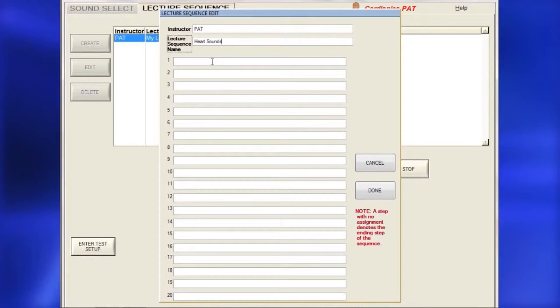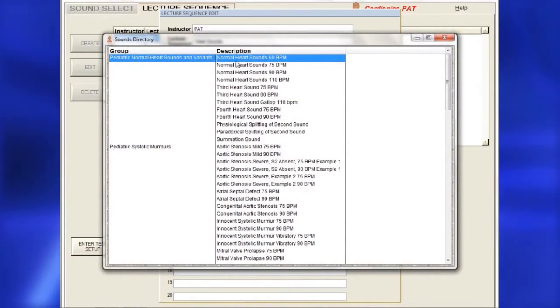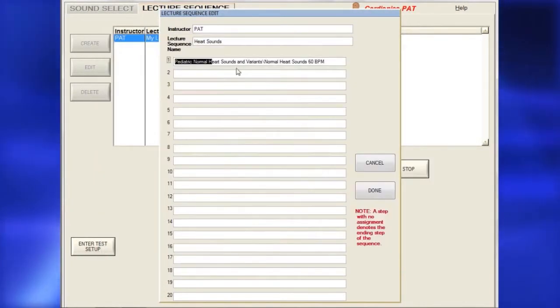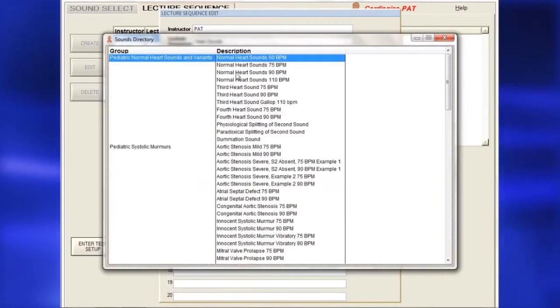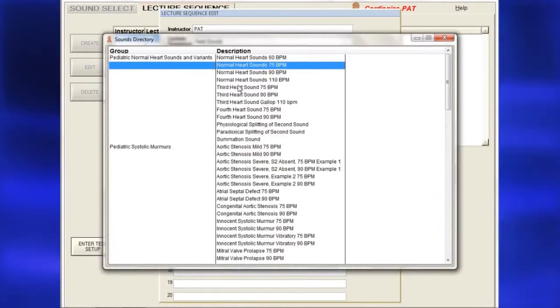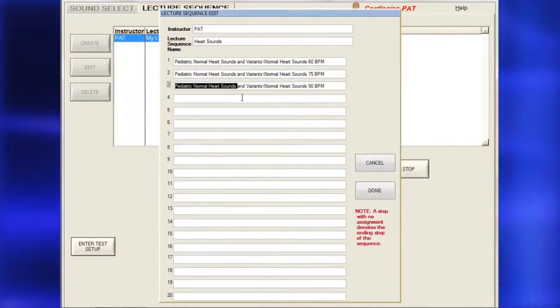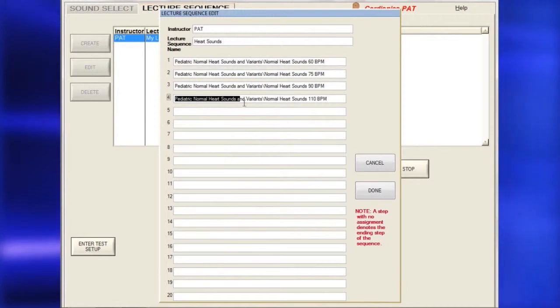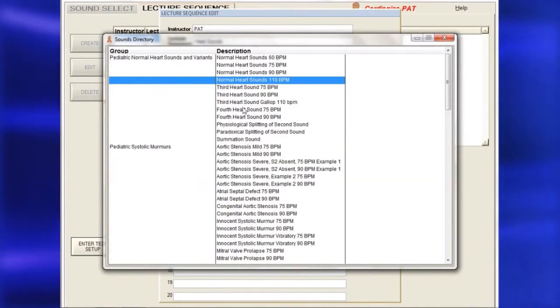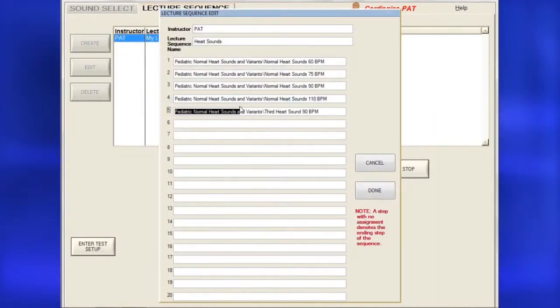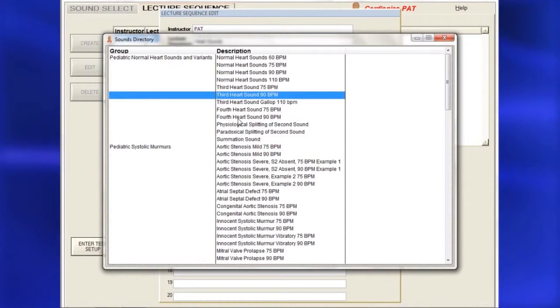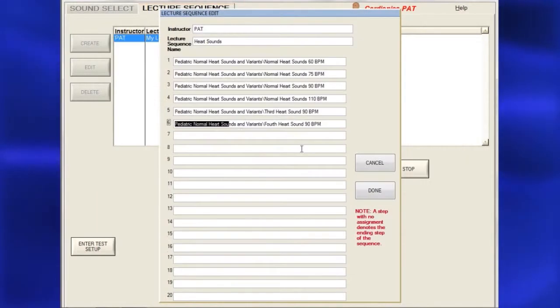Enter the instructor's name, then the scenario or lecture name. Next, double-click on a sound number to open the Sounds menu. Double-click on a sound title and wait a moment for the sound to fill in the selected sequence. When finished selecting sounds, click Done.